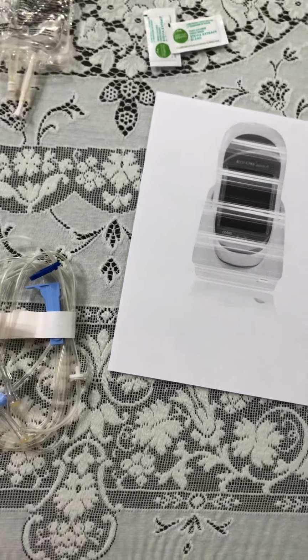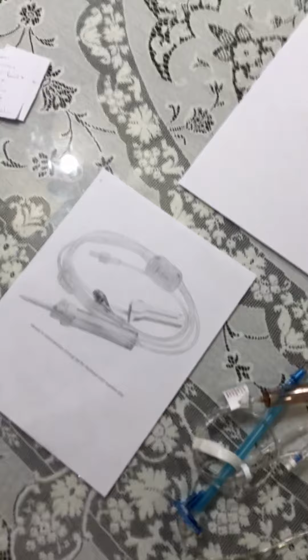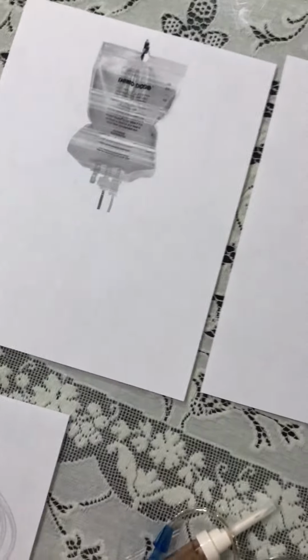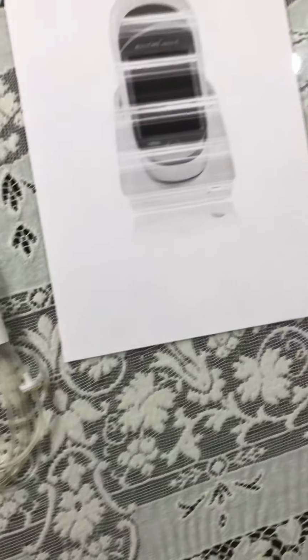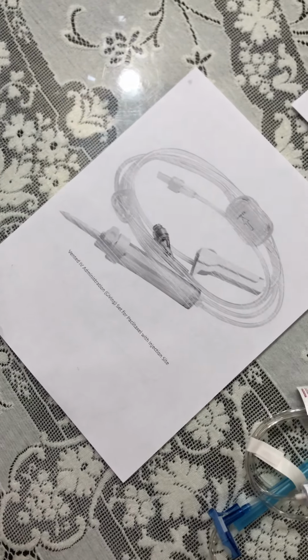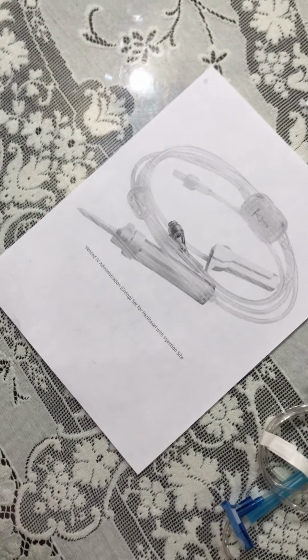Okay, so now I'm going to go ahead and perform the procedure. As you know, I've been showing you my equipment right here. So for the scale, I will need my equipment. It's going to be my TPN, my lipids, the glucometer. A scale is preferred. I could use a patient's bed scale. Tubing with a special 0.2 micron filter.